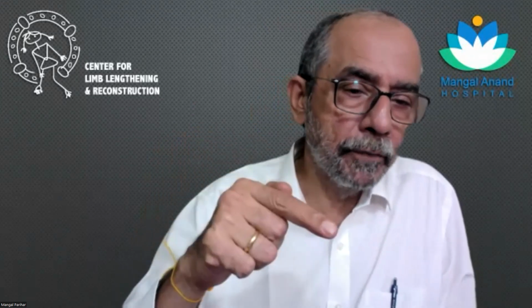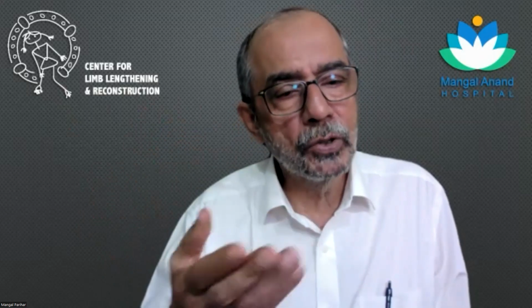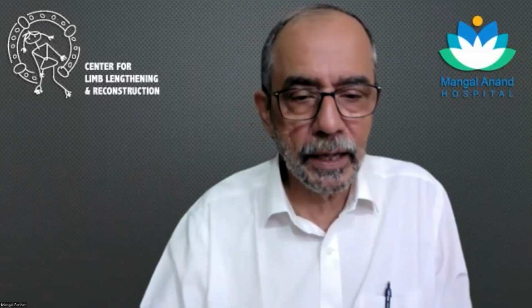Yeah. So I don't think there's a big problem perforating the cortex, but it's not good to see in the post-op X-ray that the screw is behind, because then you're worried. But I'm sure Milind will agree that this happens 2 times, 3 times at most. After that, your senses are well aware of what can happen, and therefore it doesn't happen again.